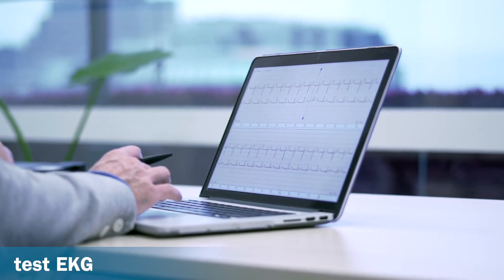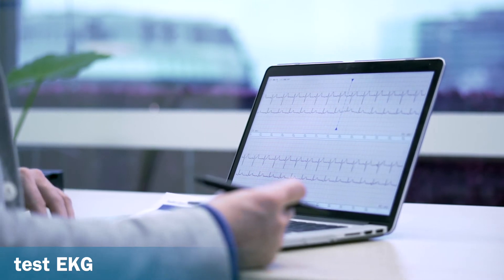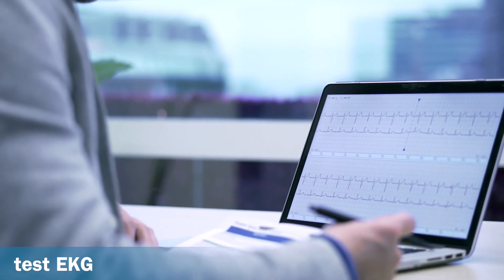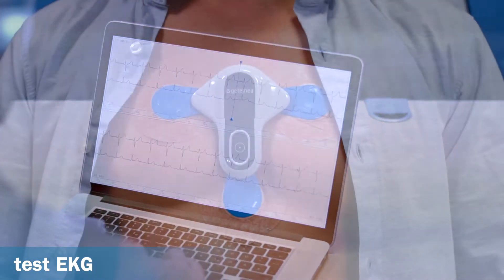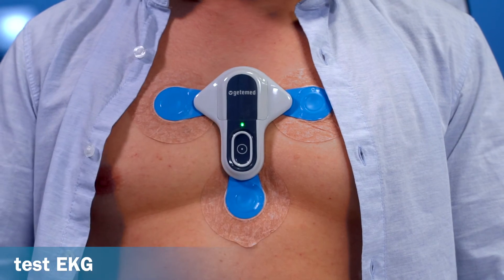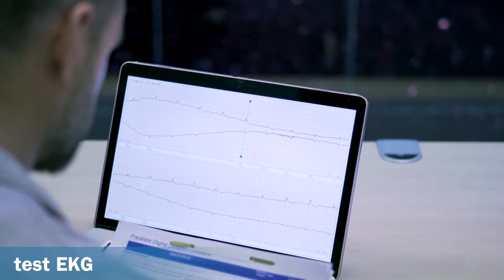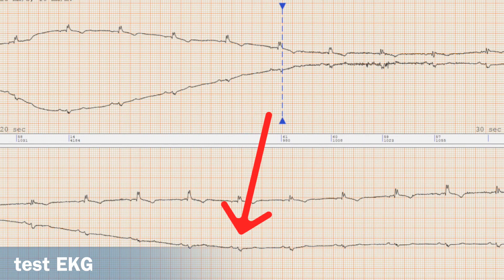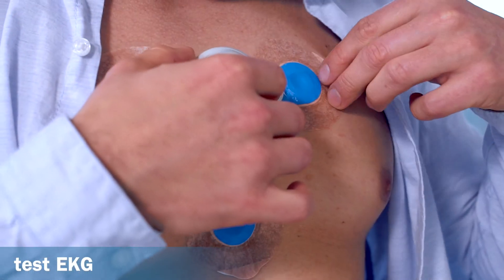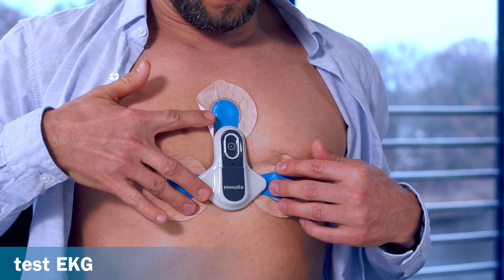In order to be sure that the ECG quality is sufficient for evaluation, a test should always be performed — either before handing the recorder over to the patient, or, if the recorder is sent to the patient, during the briefing. To do this, ask the patient to perform a manual recording and check the signal quality of the transmitted ECG. If the signal is noisy or the amplitude is low, especially in the lower channel in which the algorithm works, then a different position of the recorder on the chest should be selected in order to reduce the number of artefacts or false events.